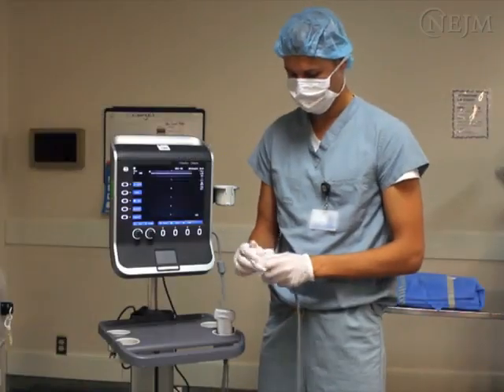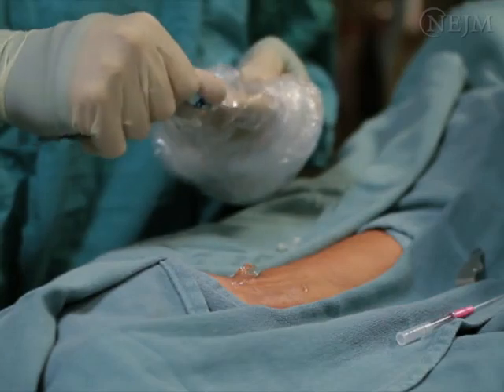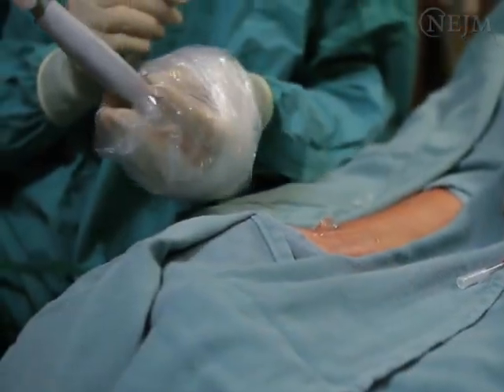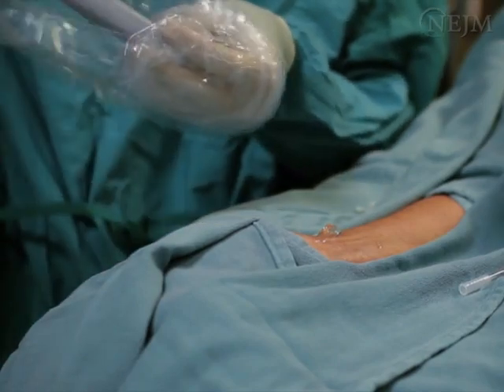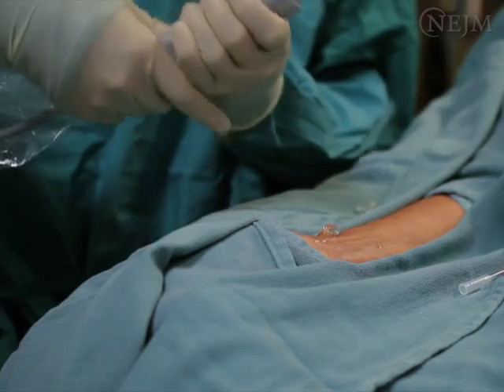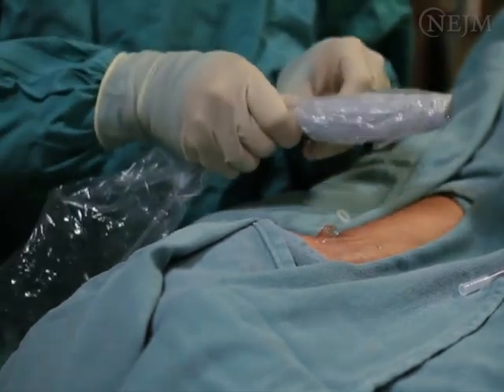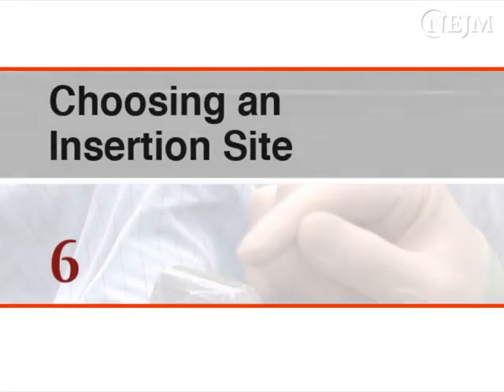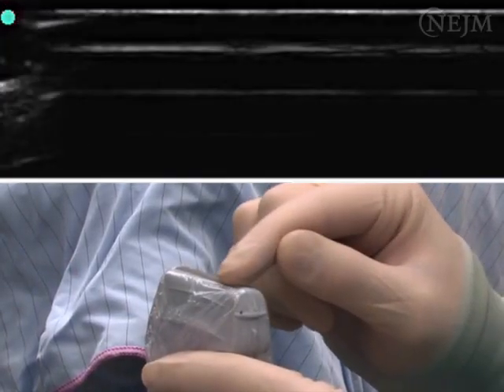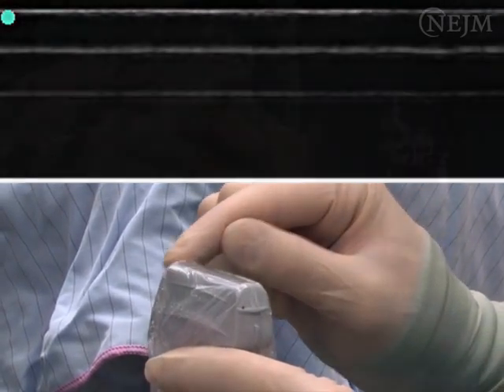Have an assistant clean the ultrasound transducer with an antiseptic wipe. Apply sterile gel to the inside of the sterile sheath and cover the ultrasound probe without contaminating the sterile gloves or the sheath. Remove any air pockets from around the probe, which if present will cause poor quality ultrasound images. Make sure that the left part of the ultrasound probe corresponds to the left side of the ultrasound screen.